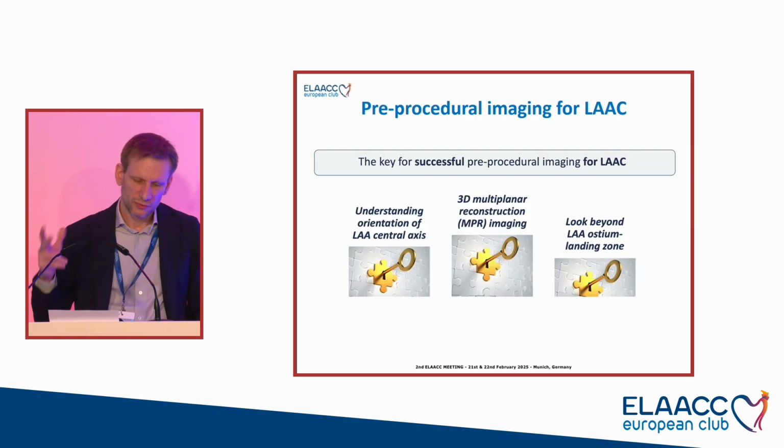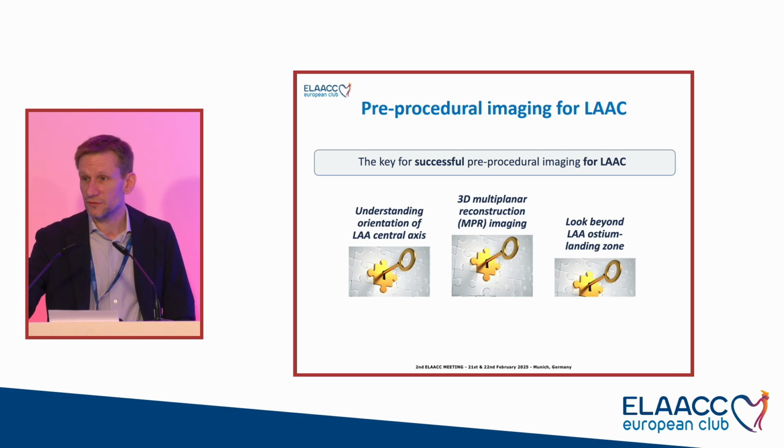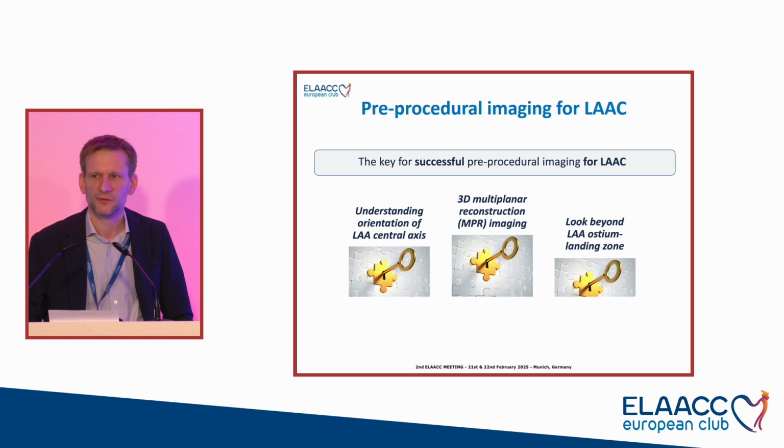So the key to successful pre-procedural imaging, if you do pre-procedural imaging, the number one, the gold medal for me, is really the 3D imaging. We have to stop doing these 0, 45, 90, 135 degree measurements on TE. It does not make any sense.